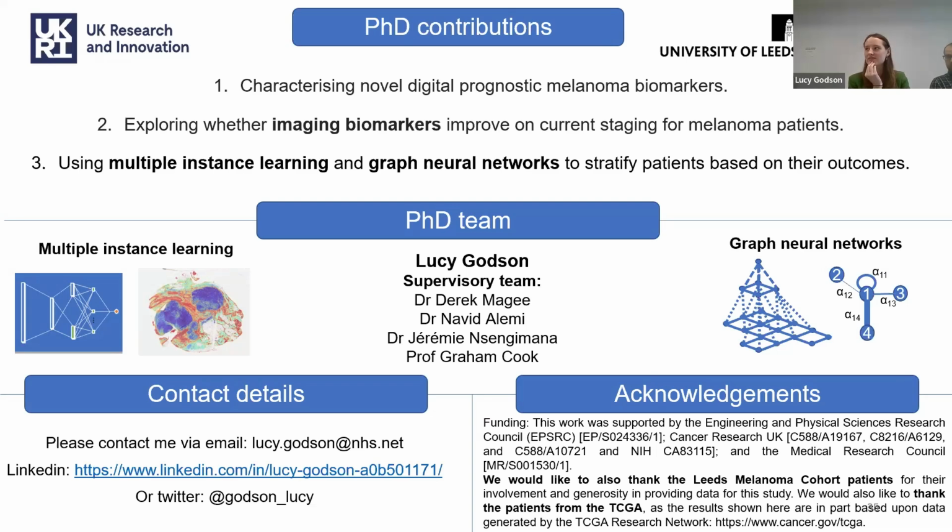Is it even possible to identify 27 subtypes of immune cells initially? I don't think so. That potentially might be the reason why the immune subgroups from the GNN model stayed significant, because they're just a massive simplification of the actual ground truth labels. Potentially they are just classifying TILs within the image rather than actually being able to classify all those 27. Yeah, because I think even a pathologist would struggle without extra staining to identify that. But never say never.